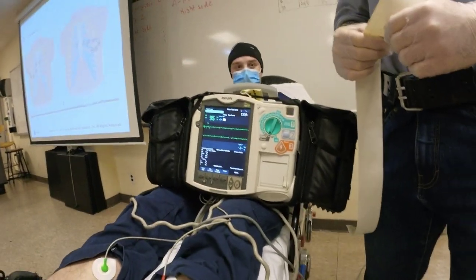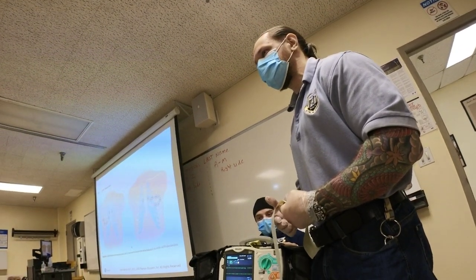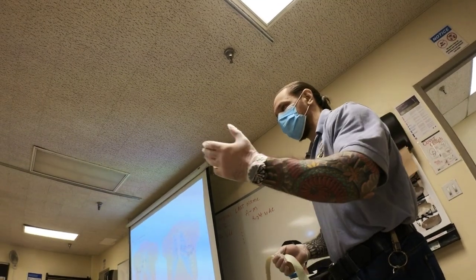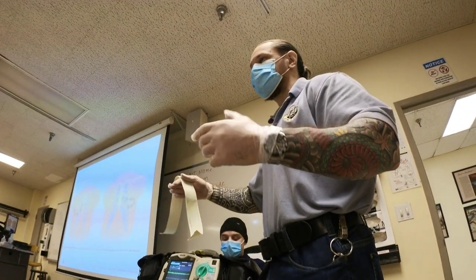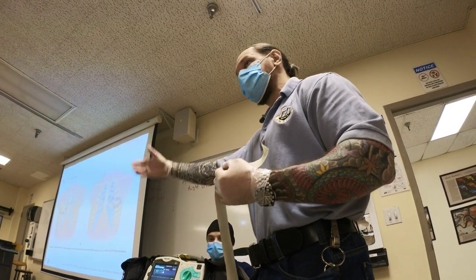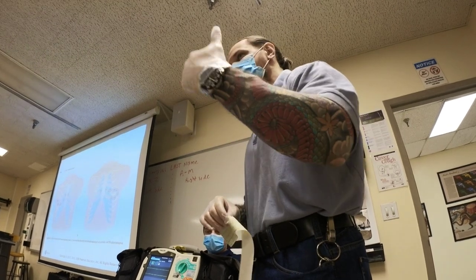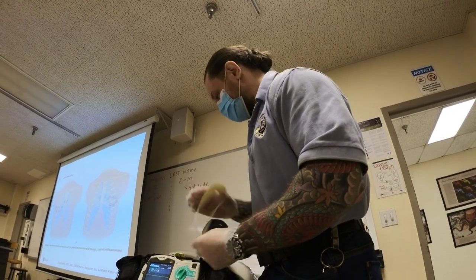So good. The reason you call online medical control and transmit the EKG to them is that they're going to call the facility. They're going to ask, is the cardiologist that's doing the procedure there? If so, they're going to say, all right, take him to this facility. Sometimes the doctor may be there only on weekends or maybe Monday to Friday. So you may be at a time frame where the doctor is not there, or they're overbooked. They have a lot of patients with cases, because the cath lab is not only for patients who have a STEMI, it's also for patients who have routine PCI, percutaneous coronary intervention. So call them up. They'll tell you which hospital to go to, and then you can initiate transport. Everybody follow? What happens if you initiate transport without calling? You get restricted. It's clear? All right.